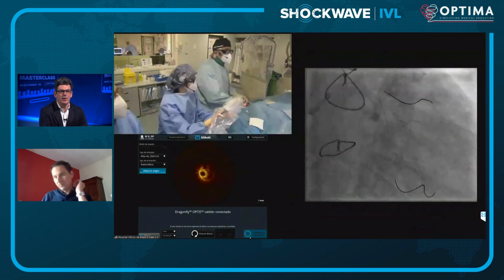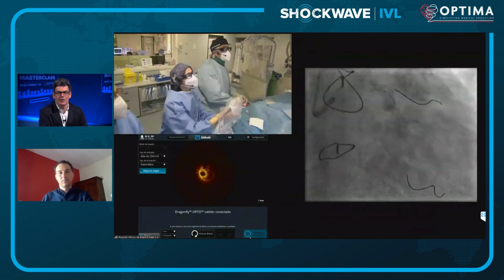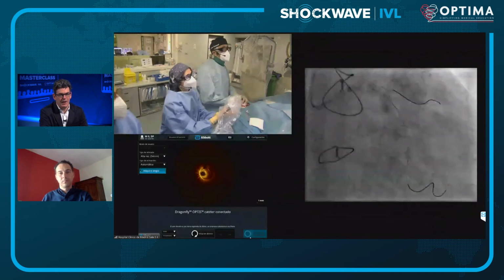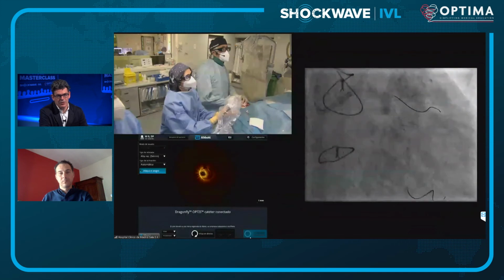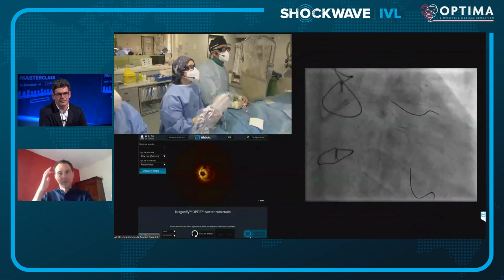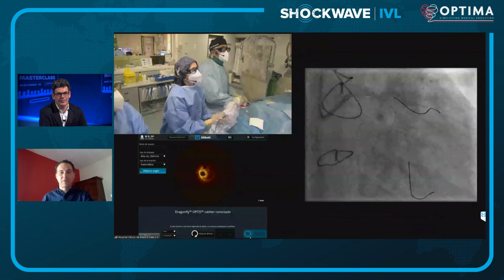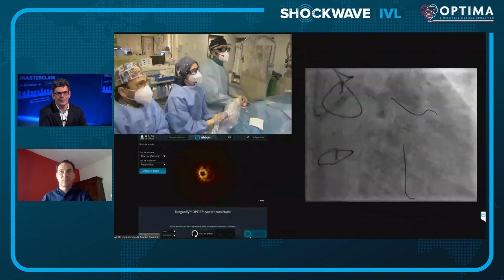So, Benjamin, perhaps whilst we're waiting for these new OCT pictures to appear, in your left main practice, are you using predominantly IVUS, or is it a mixture of IVUS and OCT? I'm still a conventional IVUS guy for left main. It's more a habit and maybe a stereotype that OCT is more difficult.